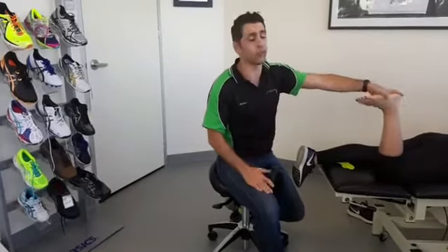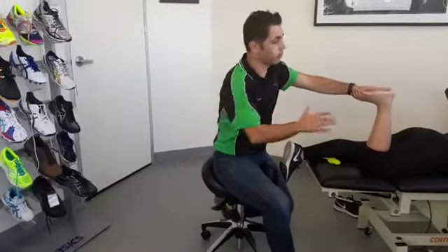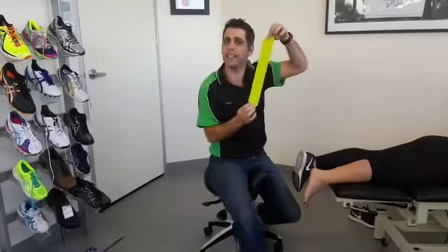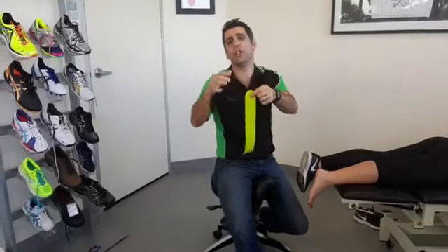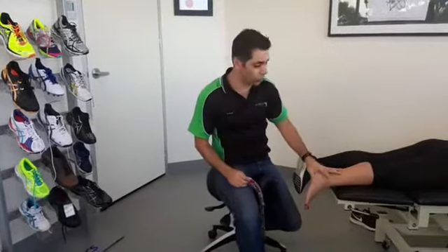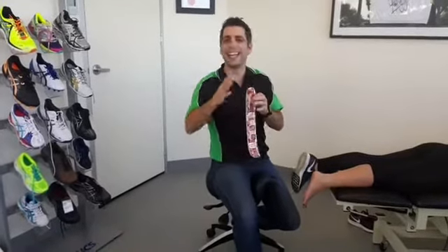If you've got an Achilles problem, watch and learn. Now, I've got my green AC Podiatry coloured rock tape. You'll notice that I've rounded the edges — really important so that when you put it in socks, the sock doesn't catch it and pull it away. Rock tape is an elastic tape, so it has an element of stretch to it. When we apply this to the foot, we'll be applying some stretch at certain points to help resist it. Kinesio tape is a really good way of allowing movement while limiting that excessive load or stretch.